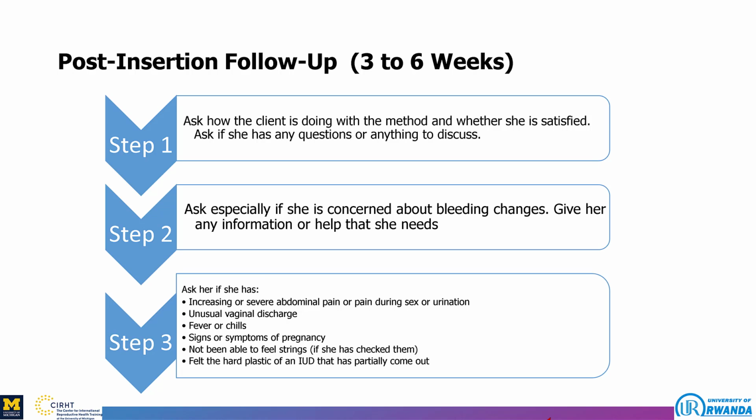For the post-insertion follow-up, it should be within the first 3 to 6 weeks. In the first step, ask how the client is doing with the method and whether she is satisfied with the method. Ask if she has any questions or anything to discuss. You have to use open-ended questions, so that you allow the client to express how she feels about that method.